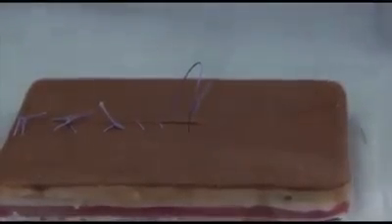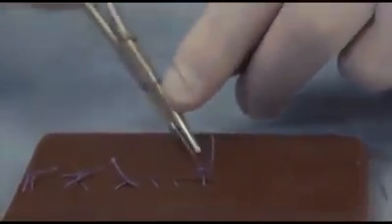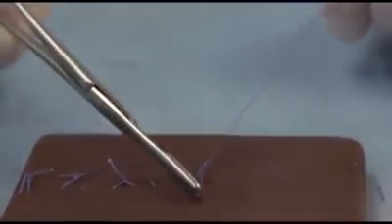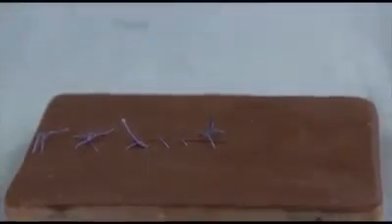When I'm ready to end my suture pattern, I'm going to keep this loop up, and I'm going to tie my loose end to the loop. And that is a simple continuous suture pattern.